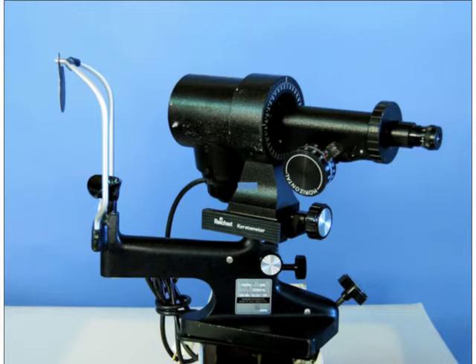Now, those are dioptric measurements of the cornea, and they're derived, and to a certain extent they're fudged, and maybe we'll get to talk about that a little bit later on. But the measurements that are actually directly measured by the keratometer are the radius of curvature of the anterior cornea. And that's the other scale on each of the dials. It may give a number like 7.65 or 7.2 or 8.0. Those are the radius of curvature. Obviously, larger values represent a larger radius, represent a flatter cornea. Anyway, next time that you're in clinic, you'll look for it.